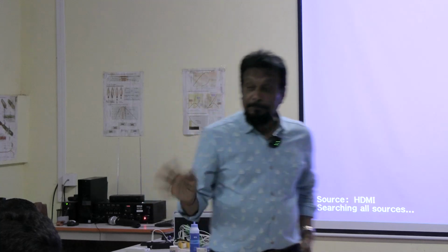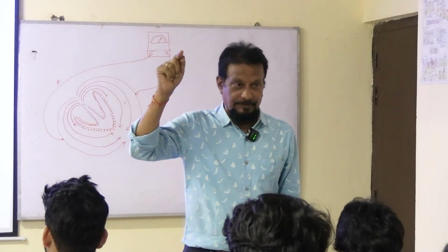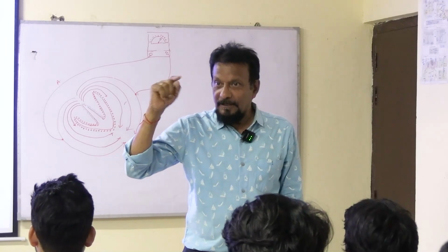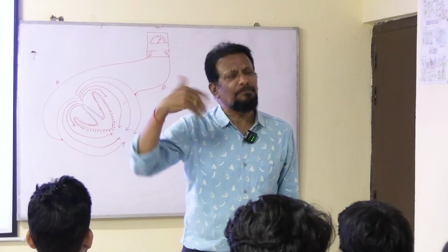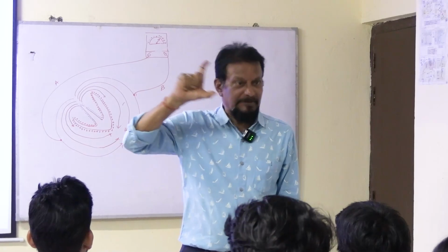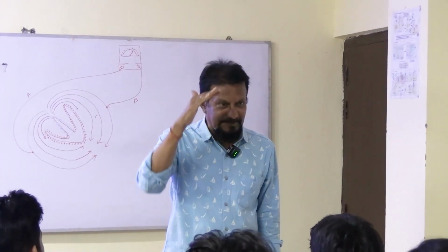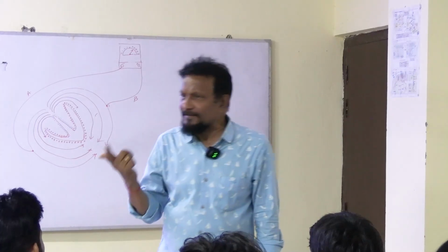So you have to know this. What do we analyze? The amplitude of the waves, either positive or negative. It may be a plus amplitude or a minus amplitude; if it is below the baseline, then it is minus.